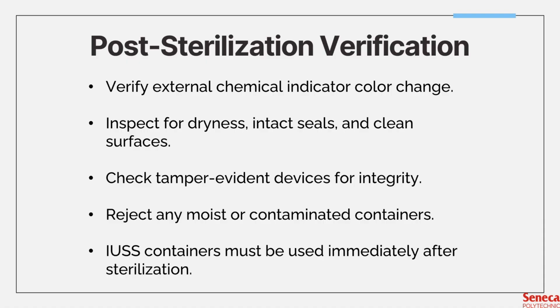For immediate use steam sterilization, or IUSS, containers must be opened and actually used immediately after the cycle. They are never stored. IUSS containers are only used in situations where there's already a procedure going on and the surgeon or any OR personnel, for some reason, dropped the instrument to the ground, and that instrument is one of a kind or is being used in another room already and we cannot replenish it for them.